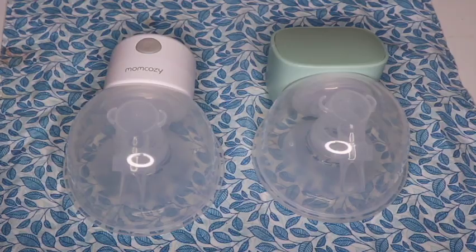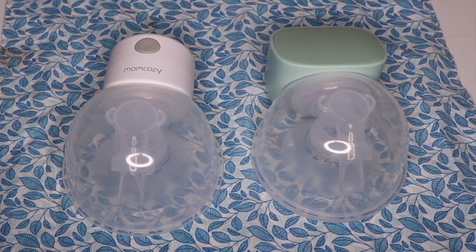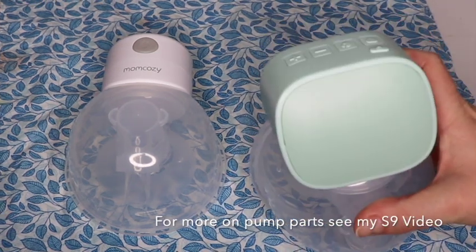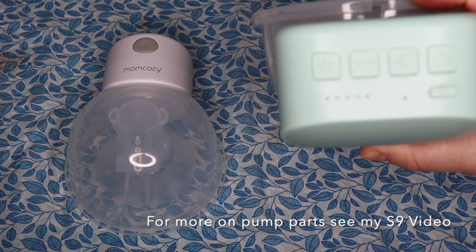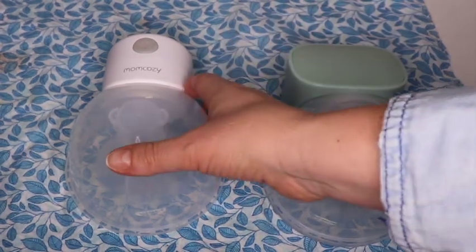Let me get this set up so we can take a closer look at its functionality, and I'll show you how to put together and take apart the pump parts. Here side by side: the S12 is on the left and the S9 is on the right. The pump parts are the same on both and they're interchangeable. The S9 pump unit is a little bit bigger and has physical buttons — it does not have a digital display.